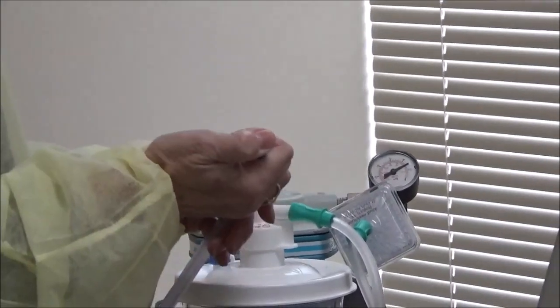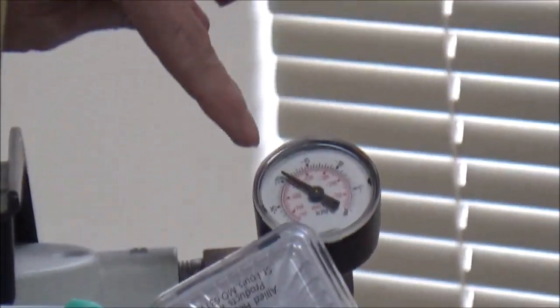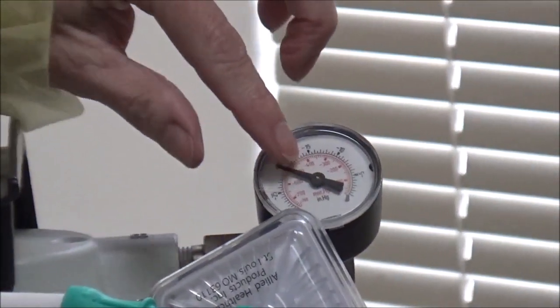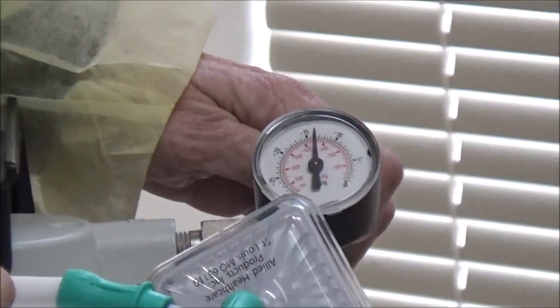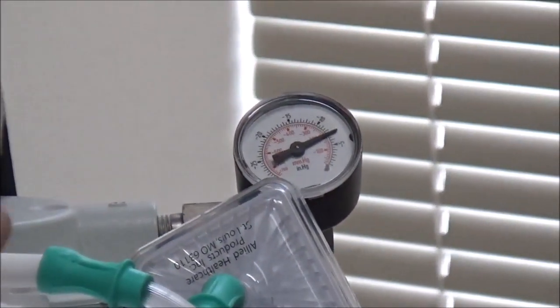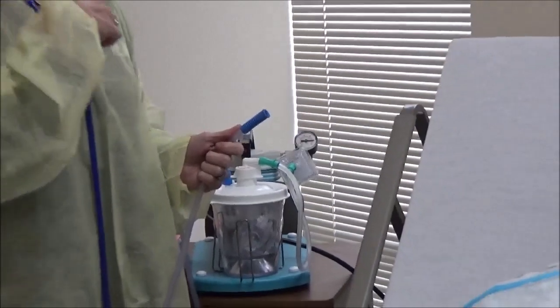And when I occlude the end of this, I need to hold it there for a few seconds because, as you can see, by holding it there for a few seconds, my suction is currently set at 20, which I know is way too high. So at this point, while this is still occluded, I would adjust my settings to be between 5 and 10. Then I can let it go, and I know that that's the maximum suction that will be applied when I put the catheter down into my client's trach.